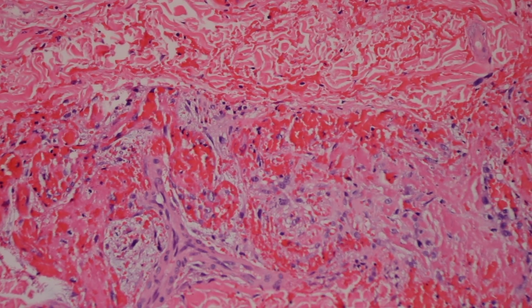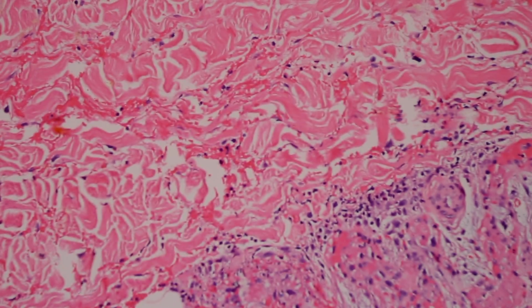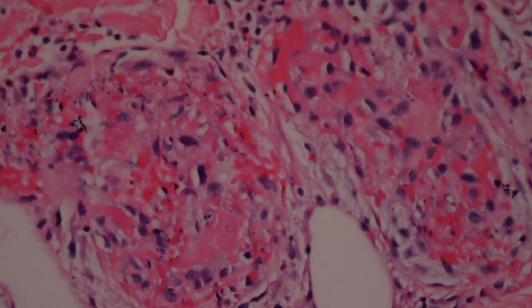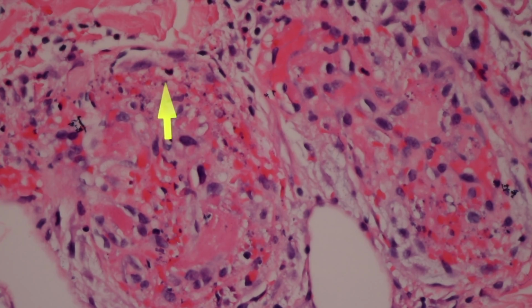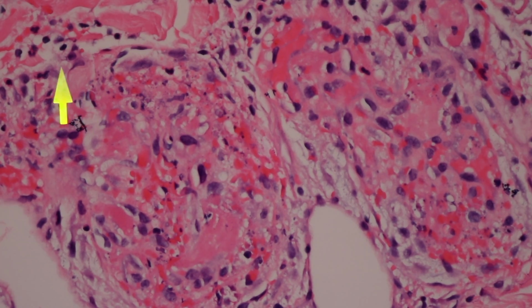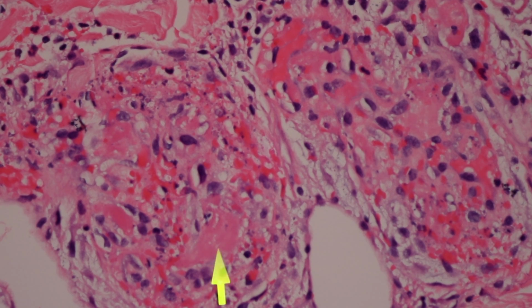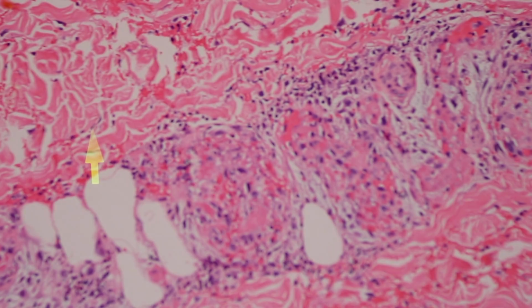But actually, there's subtle leukocytoclastic vasculitis here. Let me try to find a good area to convince you. I think this will work. You can see the presence of nuclear debris. So there are some neutrophils, not very many, a few of them here, but you can also see debris in the damaged vessel wall. So it's not just fibrin thrombus, it's fibrin thrombi with neutrophilic infiltrate, even though it's subtle, and with leukocytoclastic nuclear debris from those neutrophils breaking down.